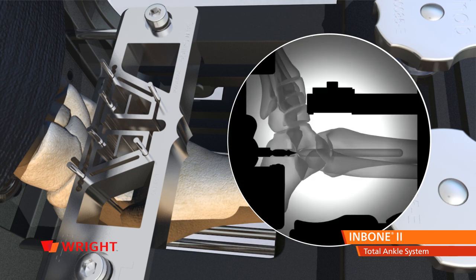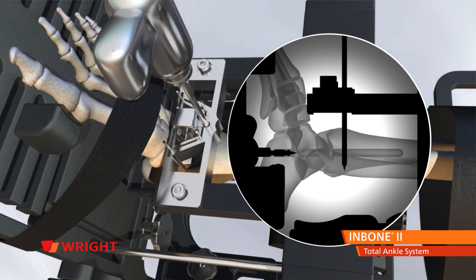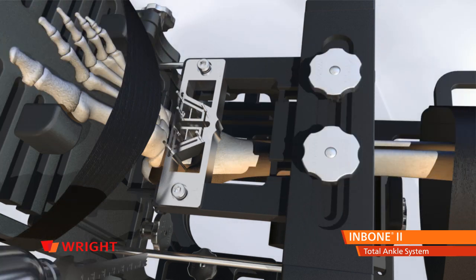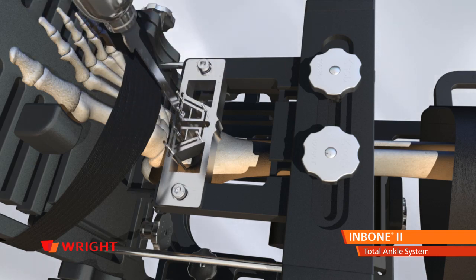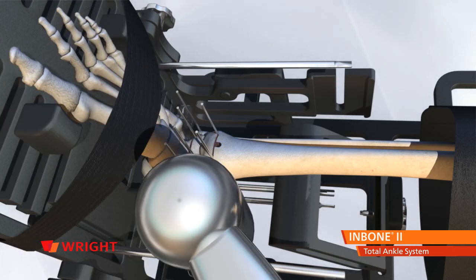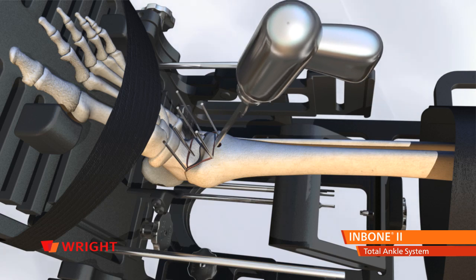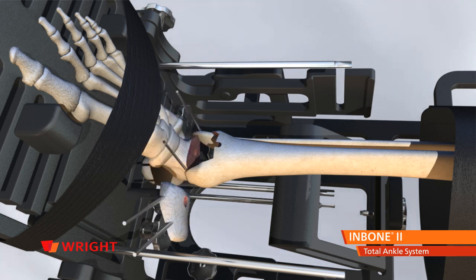Pull the drill back so it is out of the way of the saw cuts, but do not remove it from the foot. Place the anti-rotation notch insert into the saw guide. Select the proper size drill and drill through both cortices. Remove the drill and insert. Saw the tibia, talus, and the medial and lateral gutters, being careful not to cut past the posterior cortical bone. At the top of the tibial cut, use the oscillating saw or an osteotome to cut down toward the talus at 60 degrees. Remove the anterior section of the tibia so the talar section can be removed in one piece by grabbing the Steinman pins.